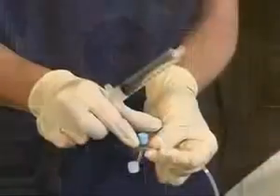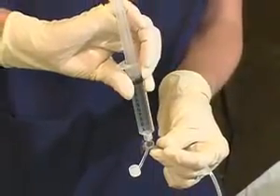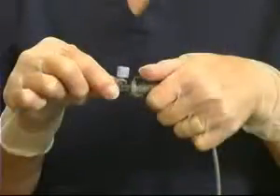Remove the blue cap from the amnioinfusion port and gently flush the catheter with 10 to 20 cc's of sterile saline. Replace the blue cap with the tethered transparent cap and reconnect the catheter to the cable. It may also help to reposition the patient.